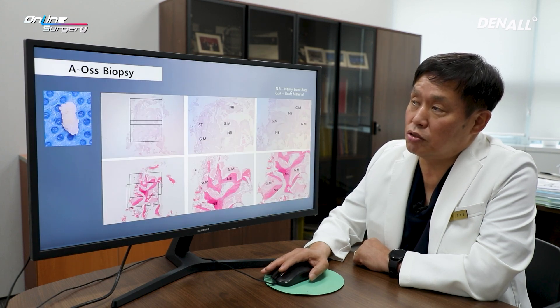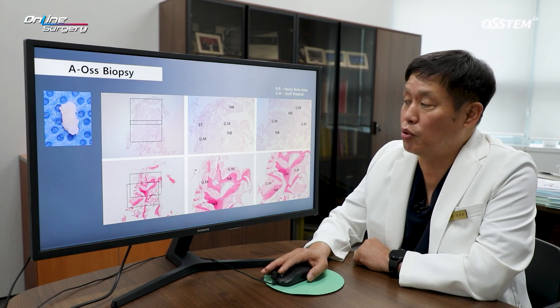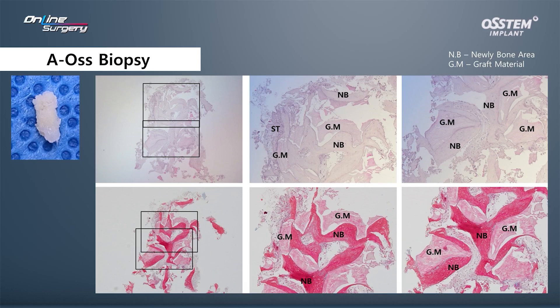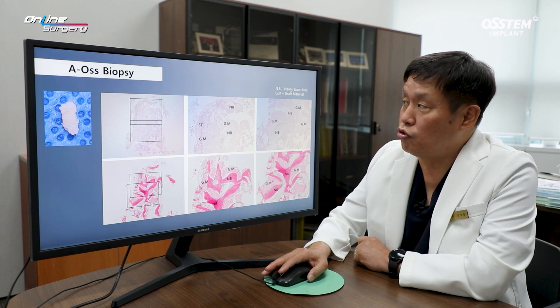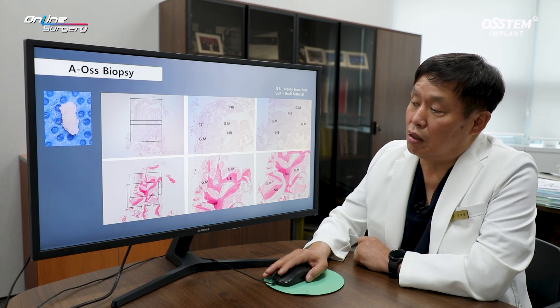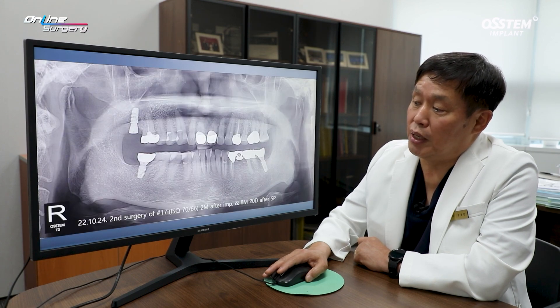At the time of surgery, a biopsy was performed. As a result, between AOS particles, new bone formation was observed. New bone was being formed in the area where socket preservation was done, and this was confirmed through biopsy. This was at the time of second surgery.